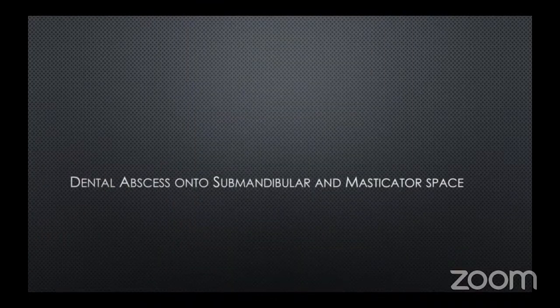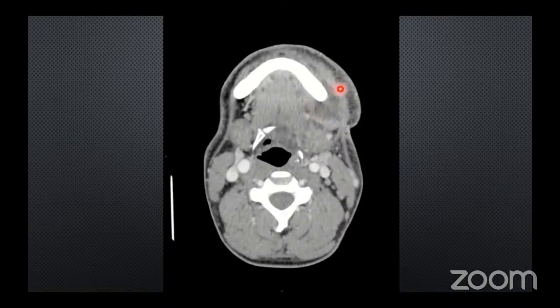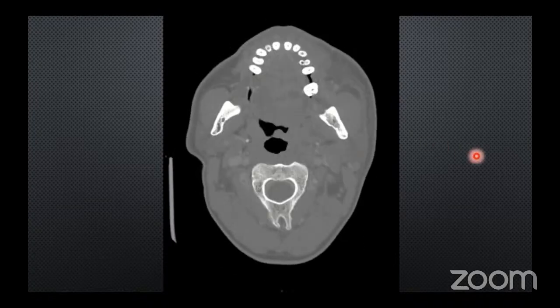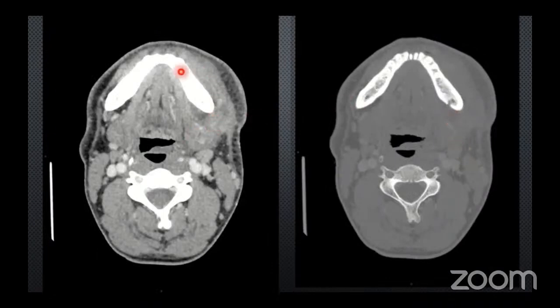So let's now look at a dental abscess that goes into the submandibular but also the masticator space. And you can just about start seeing it here, involving the upper surface of the mandible. You can see it just here, the cortical breach. I just wanted to show you, it wasn't very obvious on the soft tissue windows, but on the bone windows, exactly the same slice here, you can very obviously see the cortical breach on the mandible. So very important to look at your bone windows.